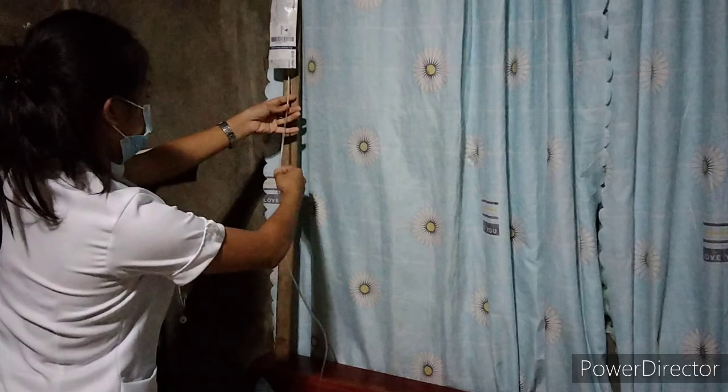Measure amount of aspirate or residual every 4 hours. This evaluates tolerance of tube feeding. Monitor finger stick blood glucose every 6 hours until maximum administration rate is reached and maintained for 24 hours. Rationale: alerts the nurse to client tolerance of glucose. Monitor intake and output every 24 hours. Rationale: intake and output are indications of fluid balance, fluid volume excess or deficit.